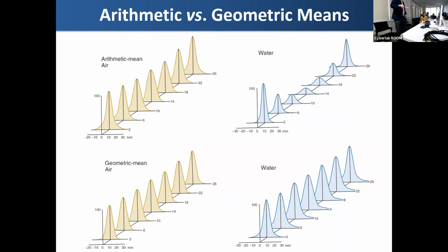So these are their mean values based on the depth, the mean values measured according to that. Okay? But in this case, it was measured in air without any attenuation material. And actually, this is the values measured with some attenuating material.